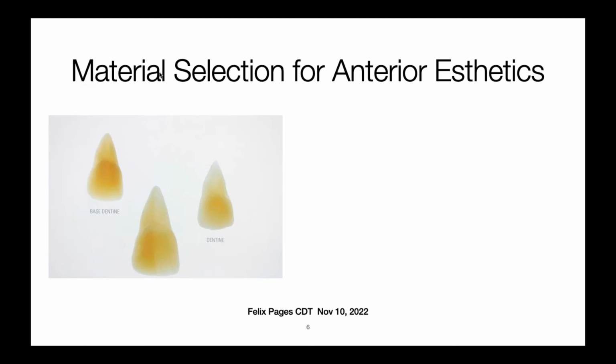If you see this small little picture that I have here, this is when Claude Sieber and Dr. Norbert Thiel and a few of us were trying to develop the Omega material and especially the VM line, the veneering material line, like VM7, VM9, VM13, and so on.